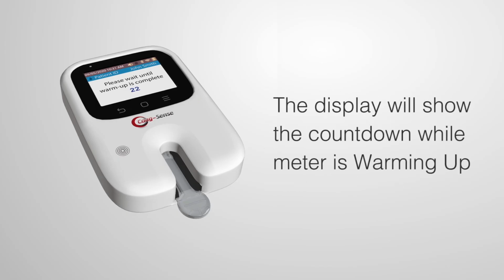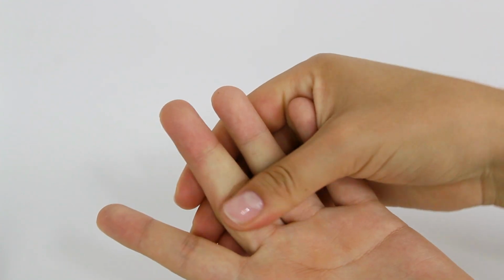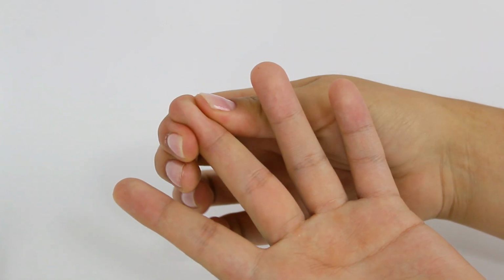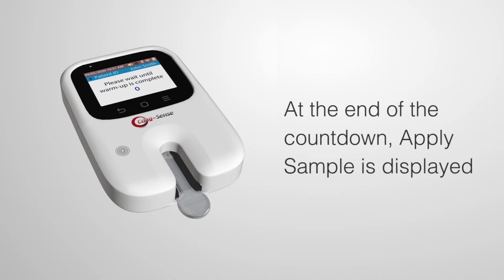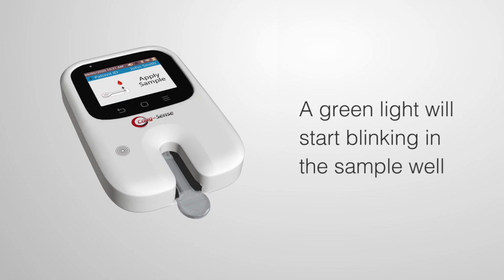The display will show the countdown while the meter is warming up. During this time, hold your hand below your heart and massage the middle or ring finger from the palm of your hand toward the last joint of the finger. At the end of the countdown, apply sample is displayed, and a green light will start blinking in the sample well.